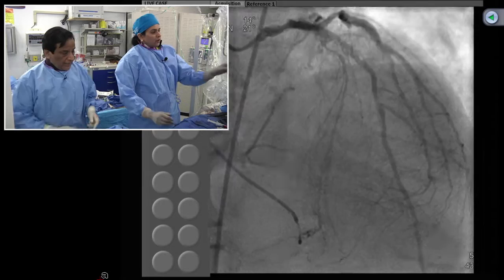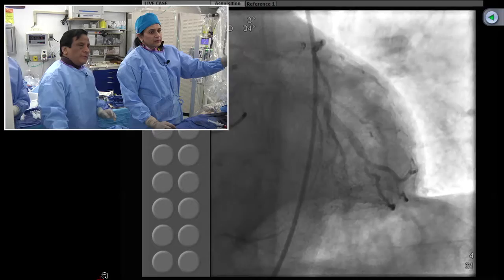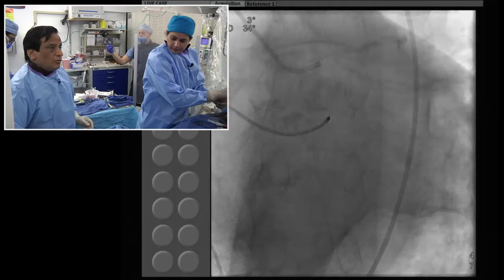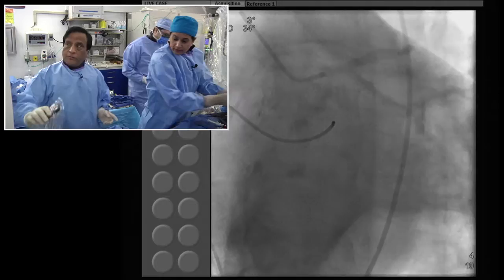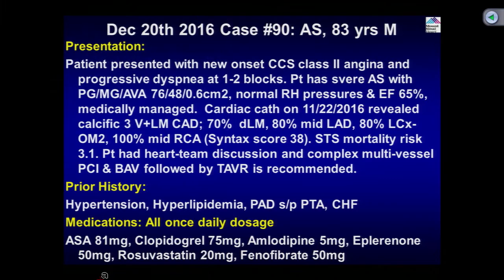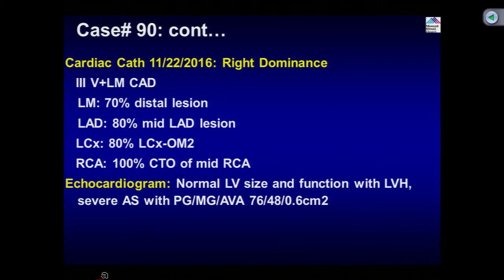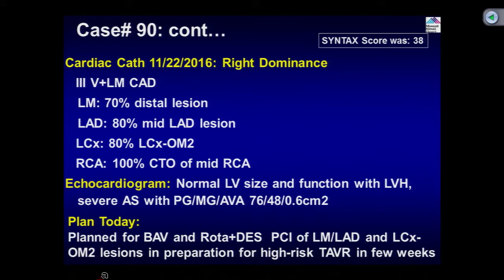Which vessel? We'll leave the circumflex alone and do left main to LAD — proximal mid LAD. Looking at the guide shot, the proximal circumflex is still okay, the large OM we'd estimate at about 60%, probably leave it alone. The left main shows significant disease, and the LAD has significant disease just after the large circumflex and at the level of the diagonal. The plan is rotational atherectomy, then stent the mid and distal LAD lesion, and stent across from the left main into the LAD across the circumflex.